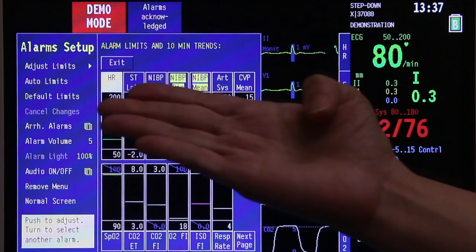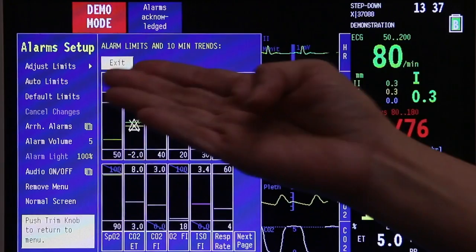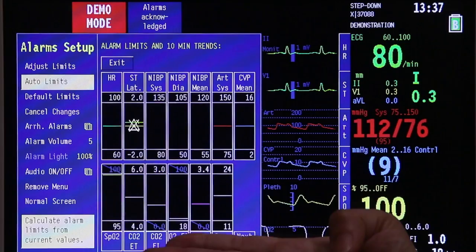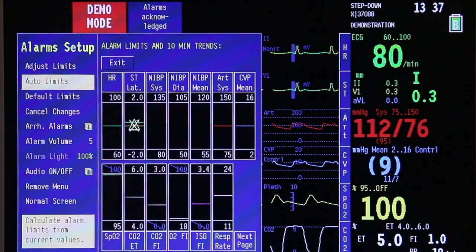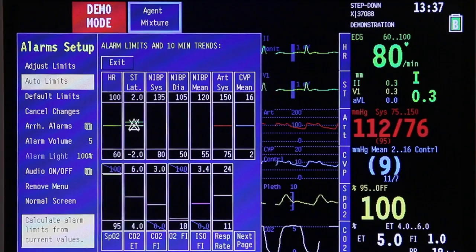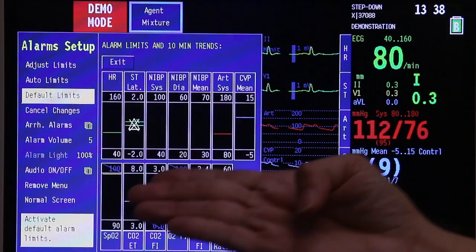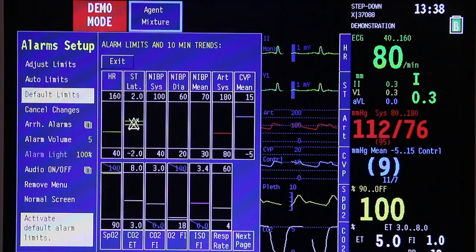Once you have adjusted the limits, go back to the previous menu to the multi-parameter limits. Aside from adjusting limits per parameter, you can scroll down to go to auto limits. When you press auto limits, they will base it on the parameters that have been recorded from the patient — usually auto limits will be 15% above what has been recorded. If you are curious to see the default limits, scroll the trim knob and press once. Default limits are based on what has been set on your monitors, and on this page you will see all the default limits for all parameters.